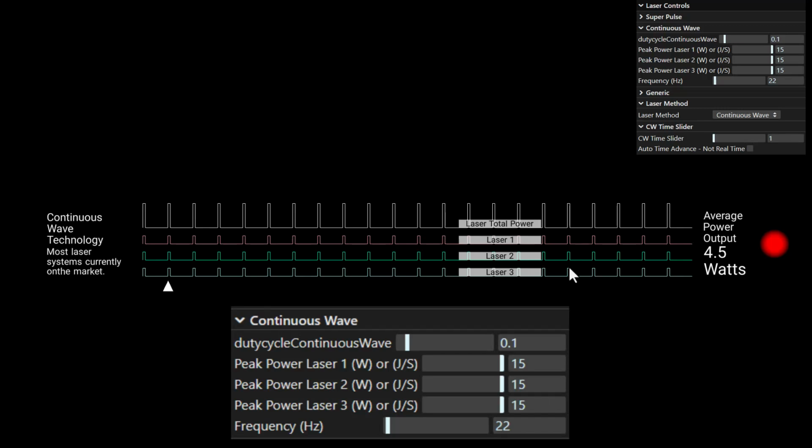Yes, you're going to get a little bit more depth than 15 watts with all three of them, but it might be just a little bit more. It's not like you're getting 45 watts worth of depth. So it'd be better if it only had one laser in it, and that one laser could go to 45 watts by itself, then you'd actually get 45 watts worth of depth, whatever that is. So the higher the power of the laser, the more depth you get. That's just the way it is in physics. It's just the way it works.